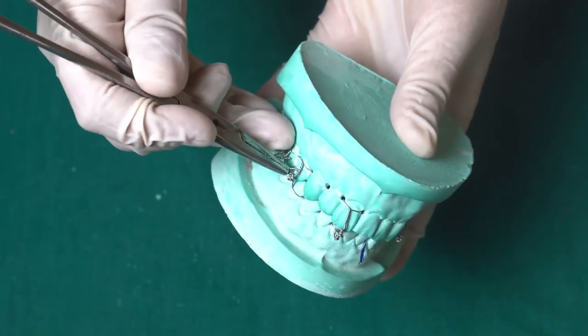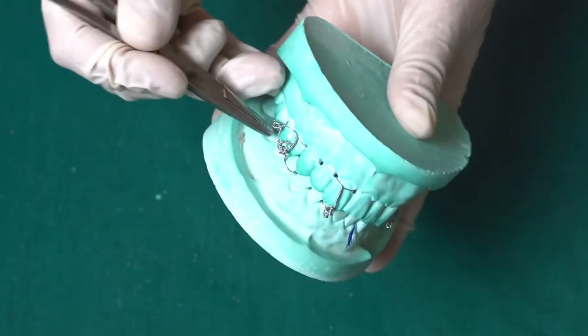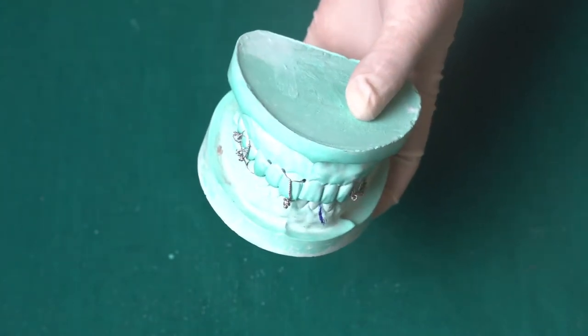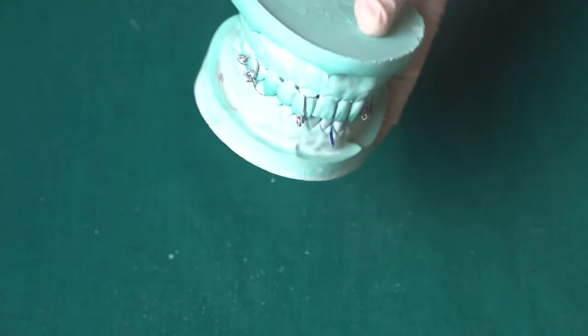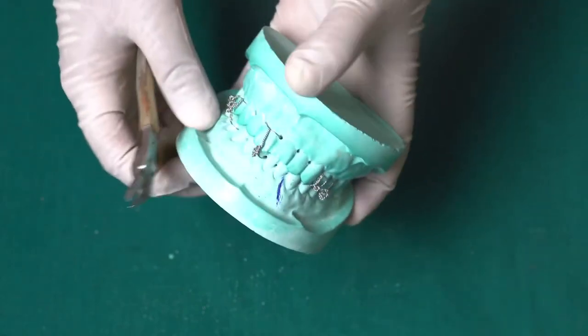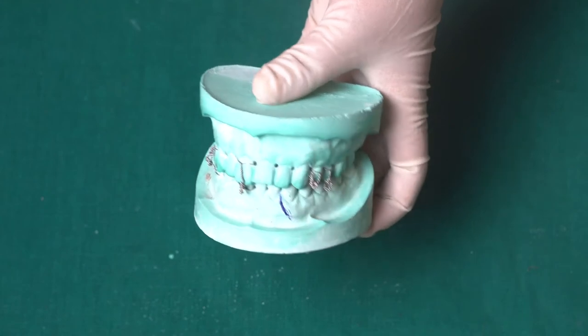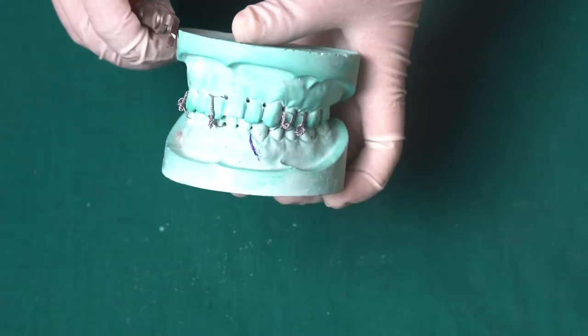Finally, you are done with your wiring. One of the main disadvantages of this wiring method is that it requires complete removal of the wire to open the mouth in an emergency situation. Even if you cut one wire, you cannot open the mouth — you need to cut out all the wires in order to open the mouth, unlike with an arch bar.